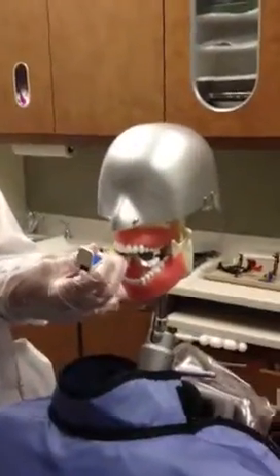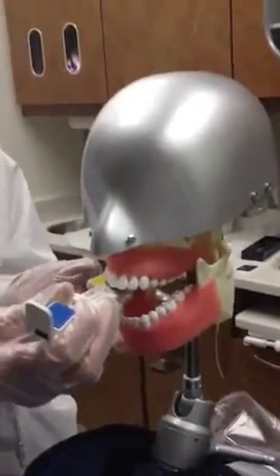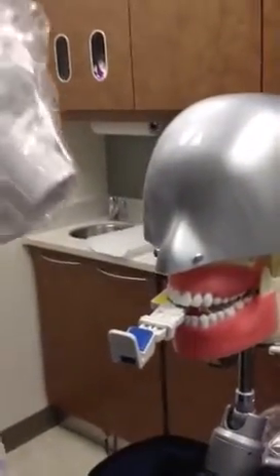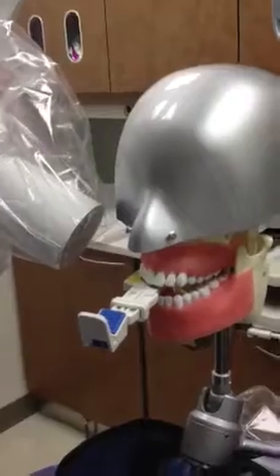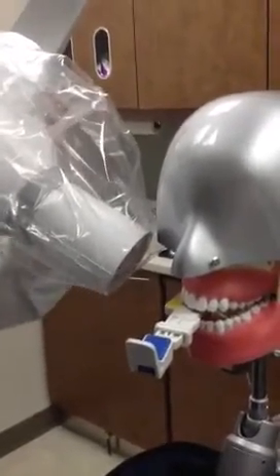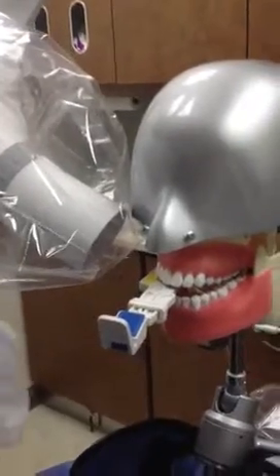I'll expose the maxillary premolars on the right-hand side. I'm using the bisecting of the angle technique, so I want to be as close to the tooth as possible. Monica is ensuring that the vertical angulation is at the correct angulation as well as the horizontal angulation, so there's no foreshortening, there's no elongation, and there's no cone cutting in the film.